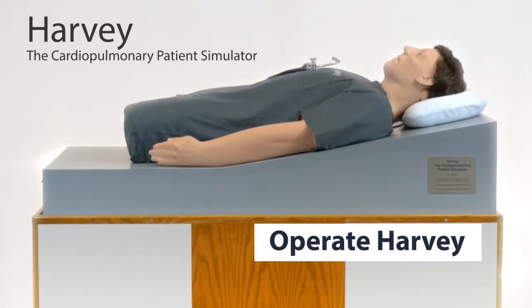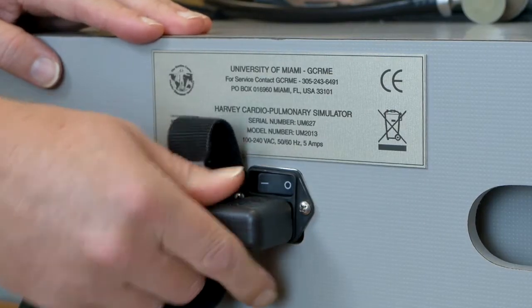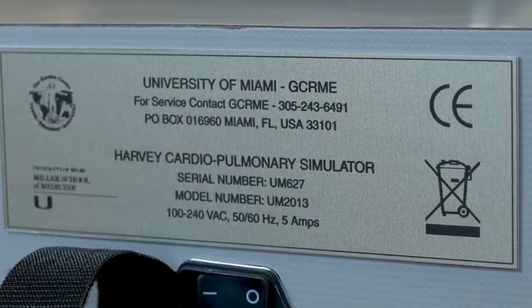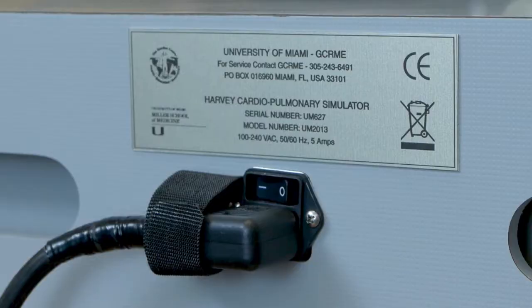In this instructional video, we will provide guidance on how to operate Harvey. Plug in the unit's power cord at the bottom of the cabinet. Harvey is 110 and 220 volts compatible. Switch the I/O selector to I before turning Harvey on.